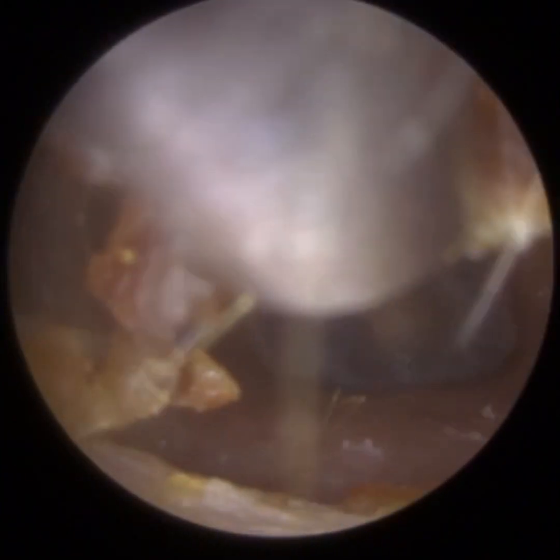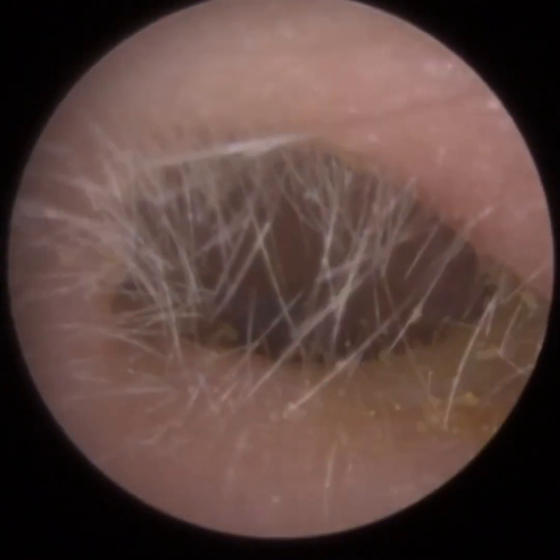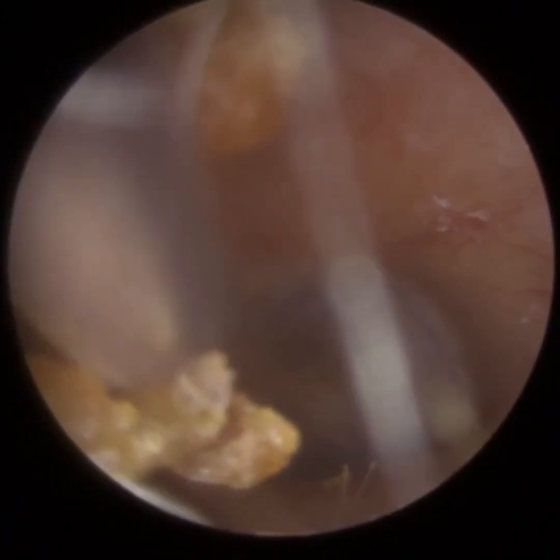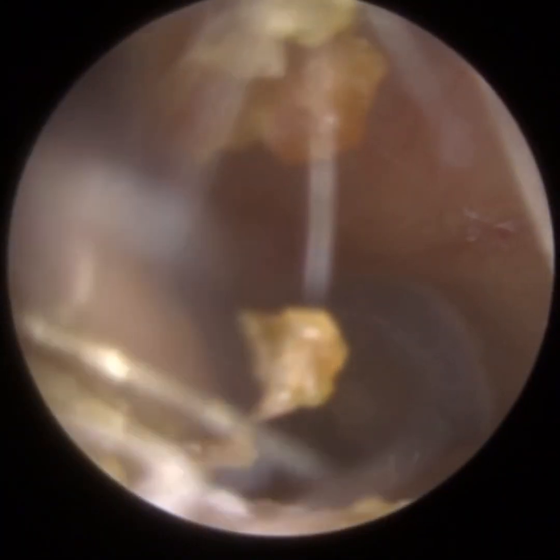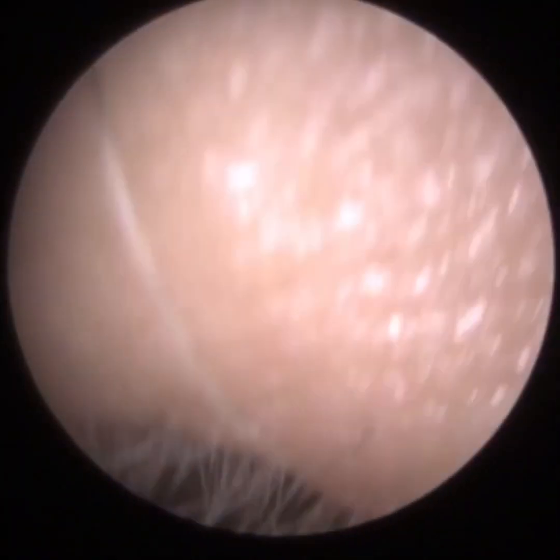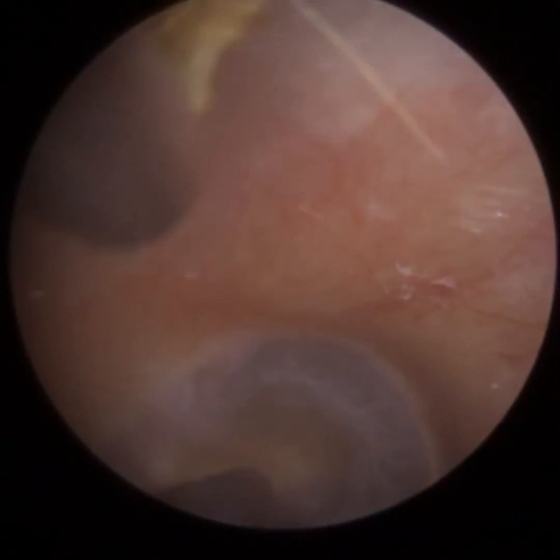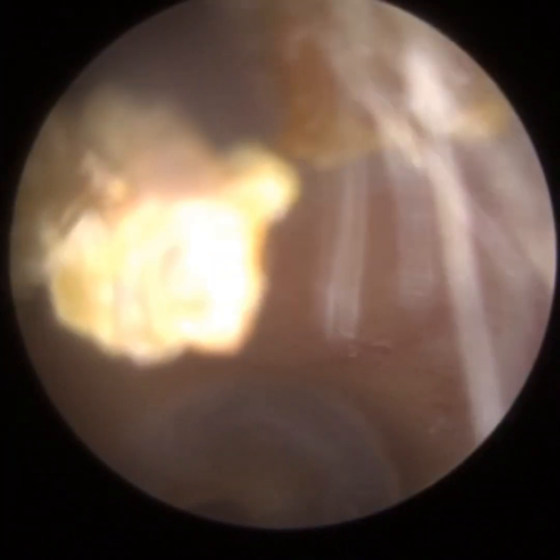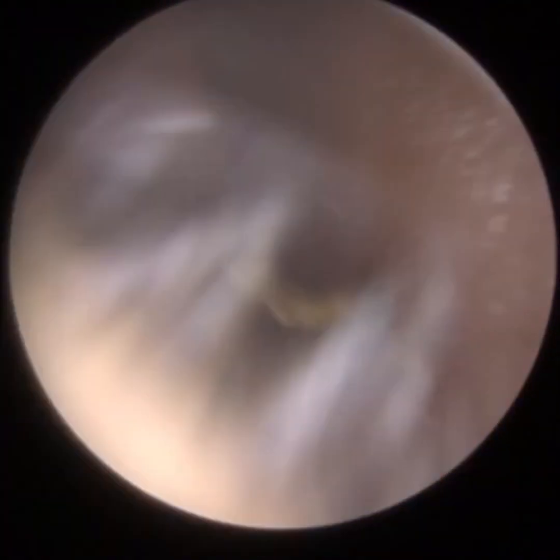You can see the occlusion's gone — we can see the eardrum. I'm just mopping up all these dry pieces of wax around the perimeter of the entrance of the ear canal. We've got a lot of questions querying why we don't trim the hairs at the entrance — and these hairs are actually there for a purpose; they have several purposes.